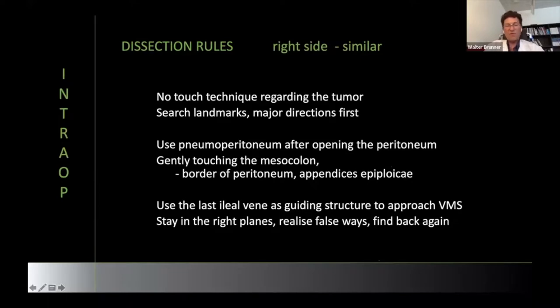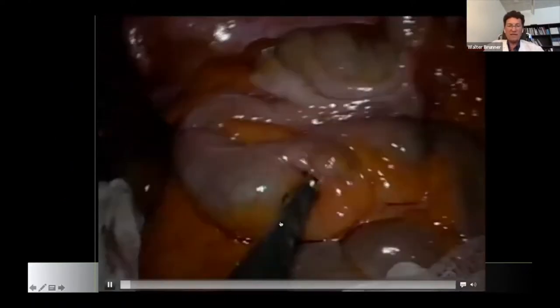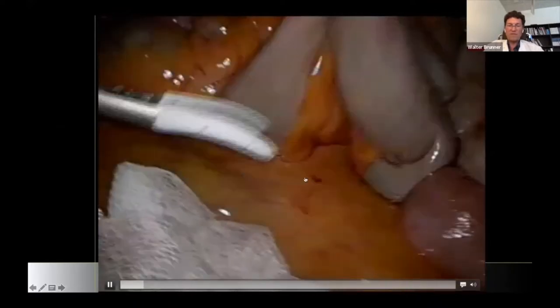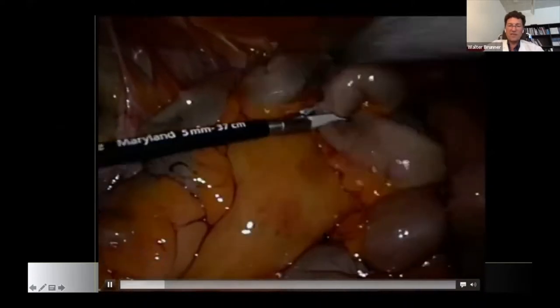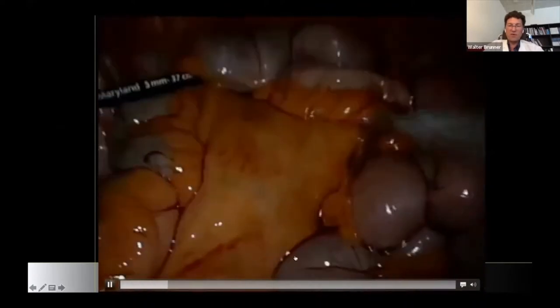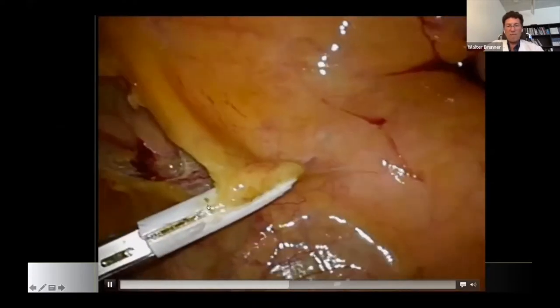Here's a short video showing how it should look in the end. These were the colic veins you may want to preserve or cut — in the end this should look complete, free of all fatty tissue. There was a question about transvaginal specimen retrieval — this is possible for the right side as well. Here we are coming through the vagina; this is the uterus. We put in a trocar and a bag, and if we separate the specimen fully from the ileum and transverse colon, we can retrieve it transvaginally. Then we can do the intracorporeal anastomosis and suture the vagina again — without another intra-abdominal incision.